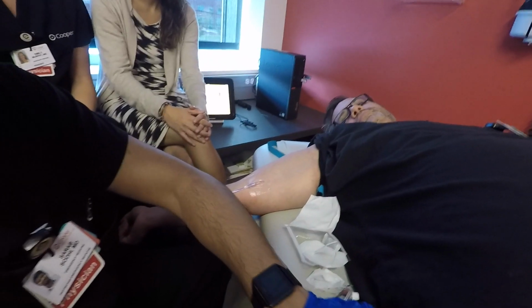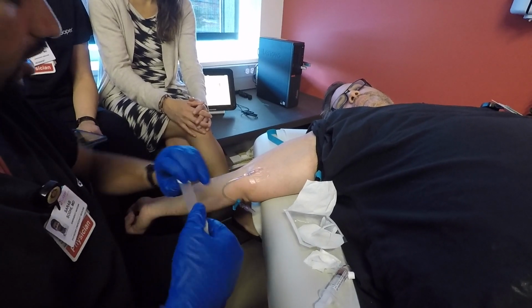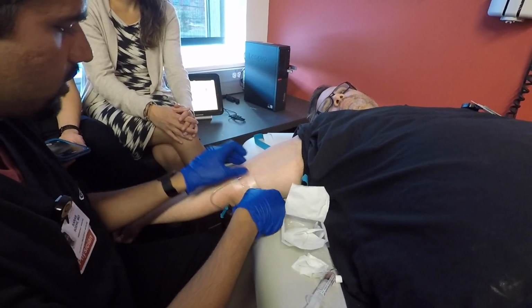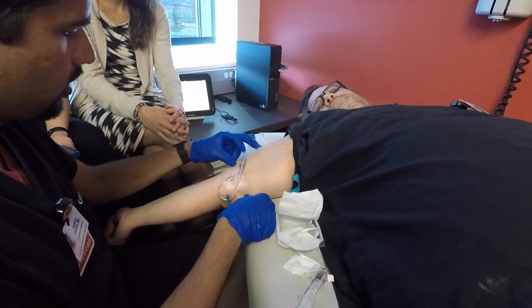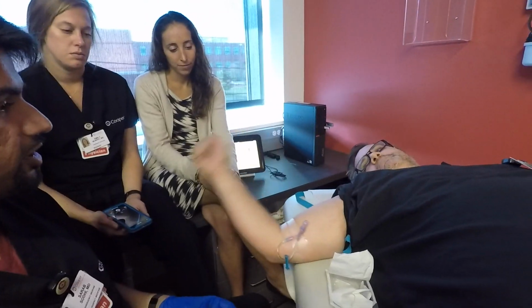But that being said, you still want to make sure it's secured well, especially if you're using this for administration of something like a peripheral pressor. So I'll tape it down once there, I'll tape it down once over the actual catheter assembly, and then I'll pull this over and tape this down a third time there as well. And that's it. And now Dr. Byrne can even move his arm.